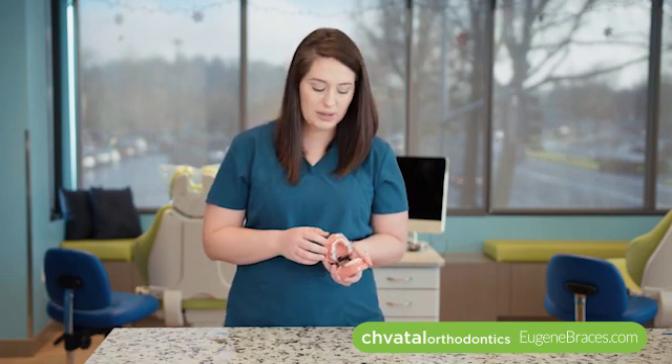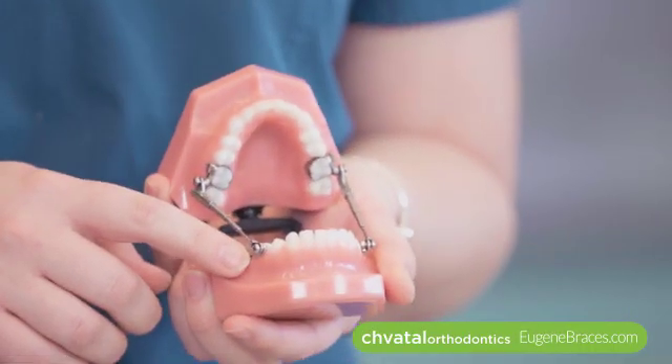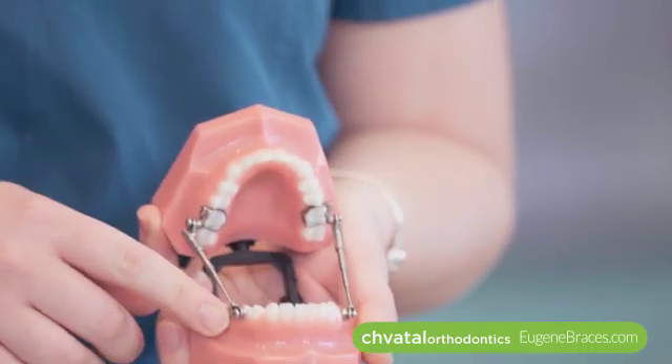The last part of your Herbst appliance we want to talk about are the bands, which is what actually holds the whole device onto your teeth. They're glued onto the molars, and sometimes that can come loose with sticky or hard foods, so watch out for those. If that glue comes loose, give us a call — we want to get that re-cemented right away.